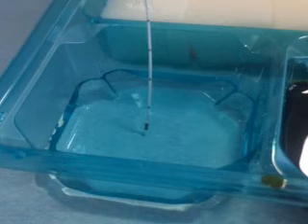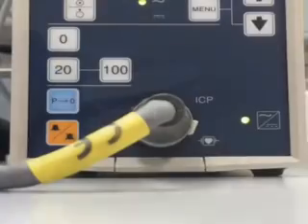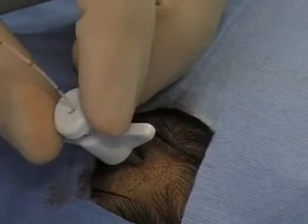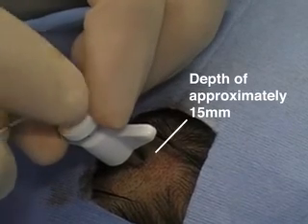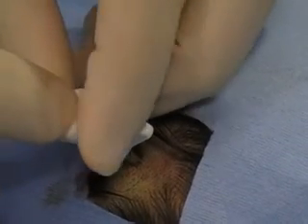Switch on the ICP transducer. Place the ICP sensor in sterile water and ask an assistant to connect the sensor to the transducer. Ask the assistant to calibrate the transducer and record the reference number. Insert the ICP sensor through the bolt to the desired depth, which is often approximately 15mm into the cranium, and then secure the sensor in the bolt by turning the adapter clockwise.